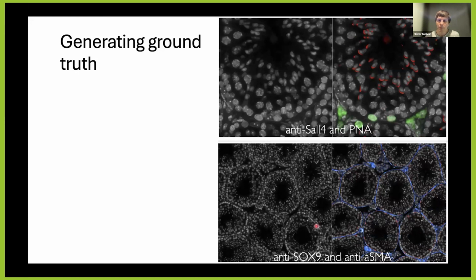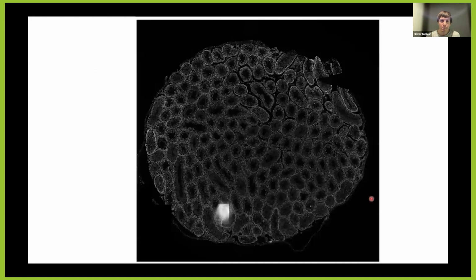And for example SMA, which is smooth muscle actin, specifically stains the borders of the tubuli. So if you use these antibodies, you can actually help to do this cell classification and tubule classification and labeling in a semi-automated way.